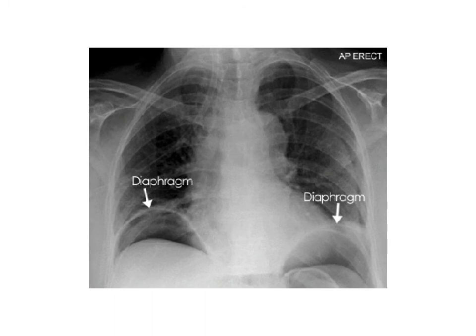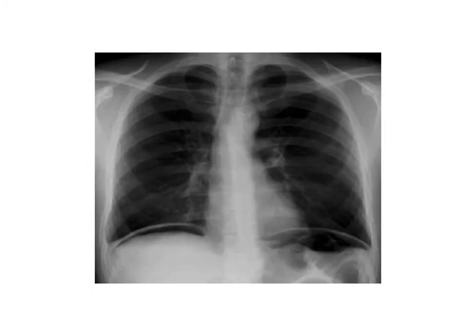So when you look at pneumoperitoneum, the thing you want to look at is the air below both diaphragms. Sometimes the air starts in the right diaphragm first. Sometimes you can see it all on the right side, and then the pneumoperitoneum is big. You can see that gas also in the left diaphragm. This is another example of pneumoperitoneum.